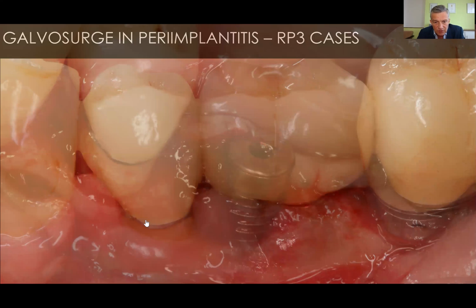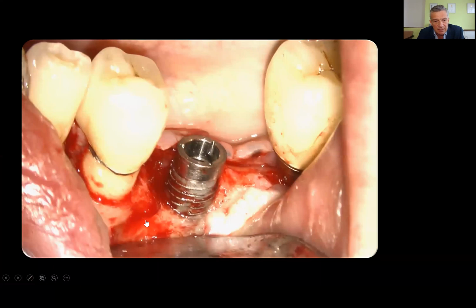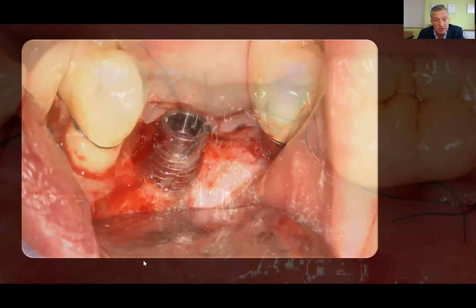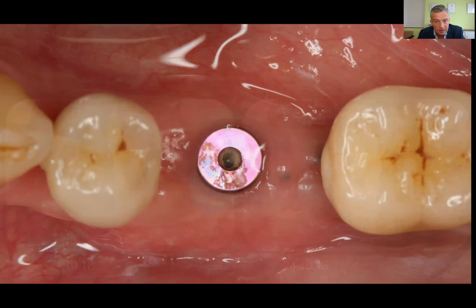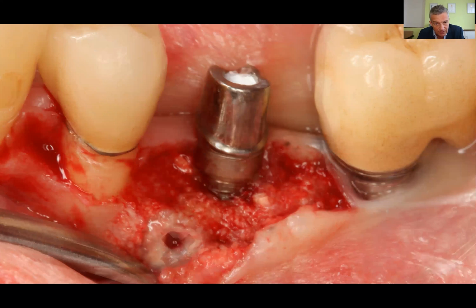And another case, the defects are getting bigger and bigger, as you can see. We cleaned it. I don't think it's necessary to share the same. This was the control group. And then after we did an electrolytic cleaning, of course, and the healing, the X-ray after augmentation. And of course, in this case, we had to suffer an exposure. This was the site after reopening after 6 months. The umbrella screw almost integrated in the augmented bone. And as you can see, severe bone growth was assessed.